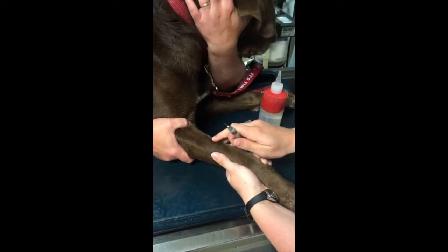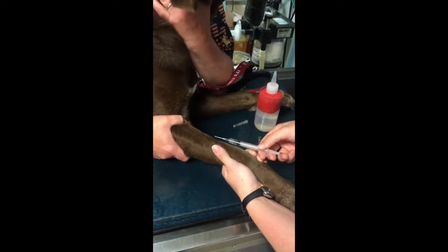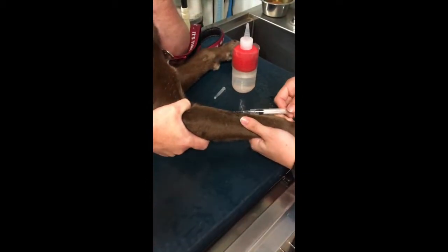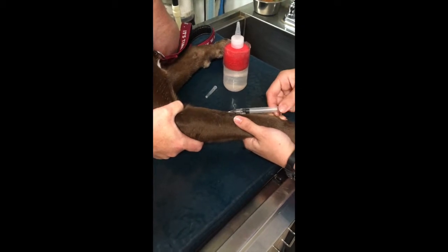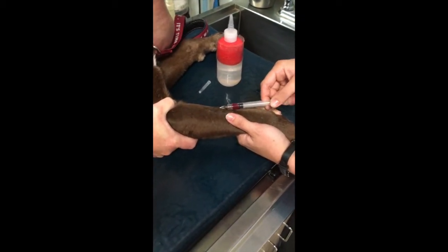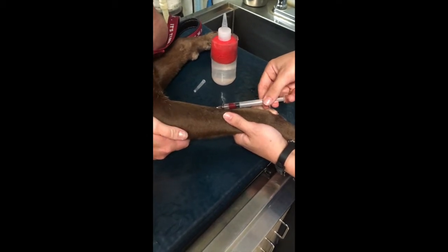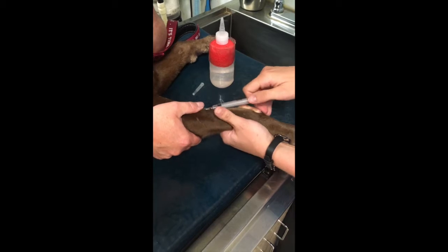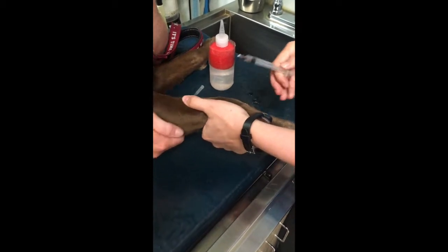Palpate for the vein. Make sure that bevel side is up. Good boy. Oh, settle. It's okay. It's just a pick. You're such a good boy. Okay, so now that I have the blood, my assistant is going to let go, and I'm going to slowly inject. Then hold off. And there we go.